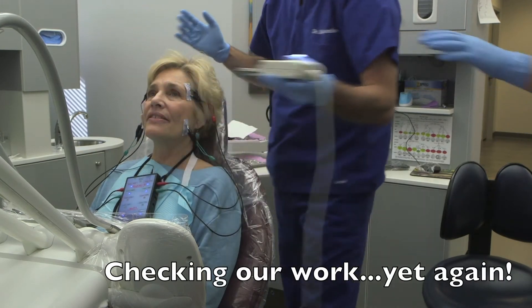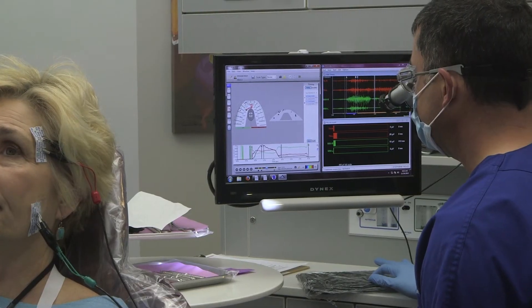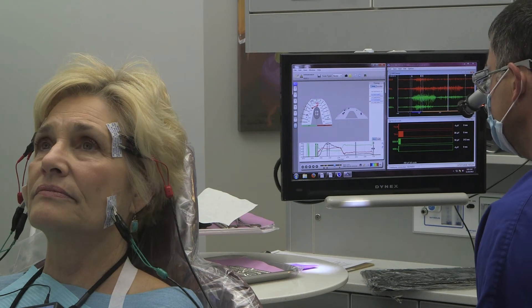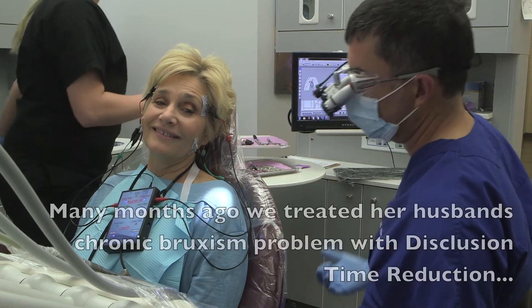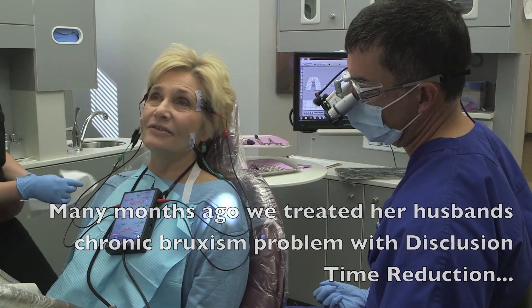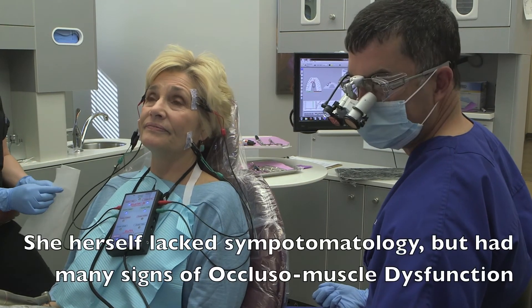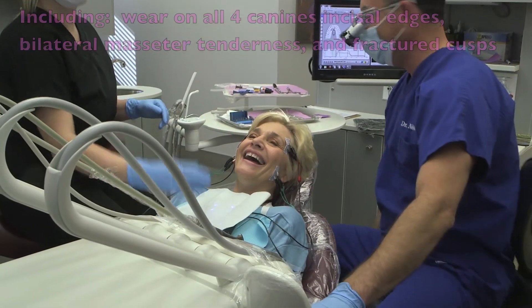That looked like it was easier — was it? That was a lot easier. It's amazing. It's so surprising — you wouldn't think it would make that much difference. And I'm not doing much — I'm not in there very long, not taking a lot away. He did my husband, and I used to lie in bed listening to him grind his teeth at night. He doesn't do it anymore — zero. That's brain being happy. And he doesn't have any pain anymore at all.